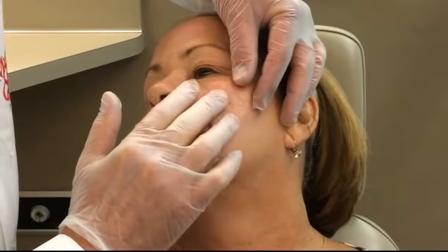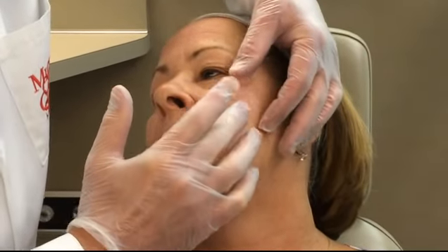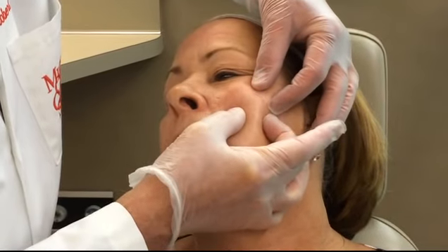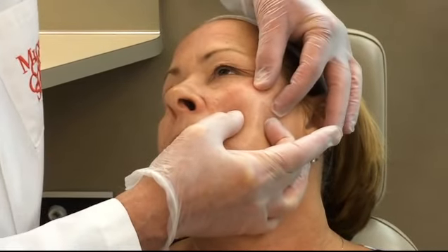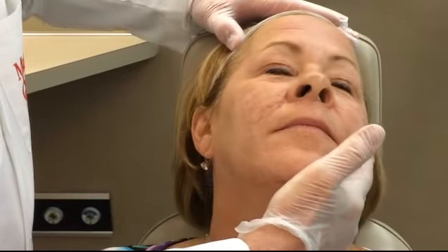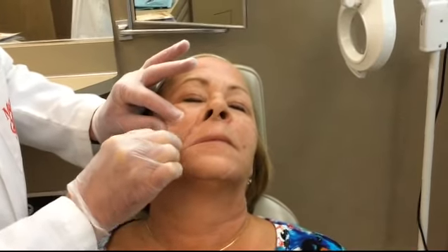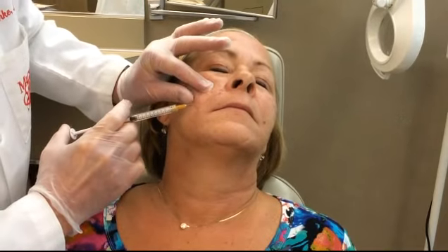And then we're going to go to this area right here, which is a little bit more scarring, but when we push on it, it distends, which means that it should do fairly well with the volume in there. I've already done several preps here, but I'm going to do another prep, this time with alcohol, prior to the injection. I've got the Bellafill syringe here, and it has a special needle on it that actually helps to lift this up.